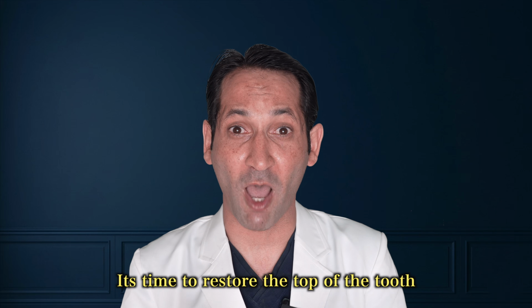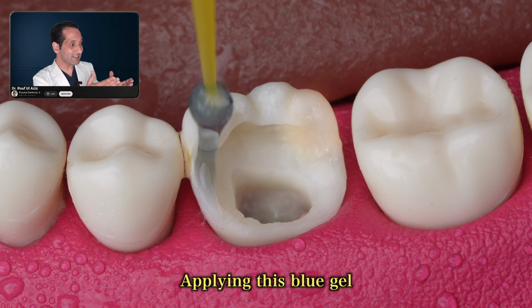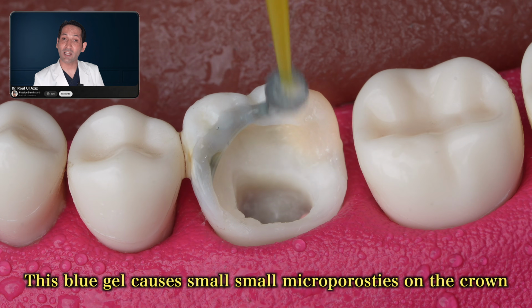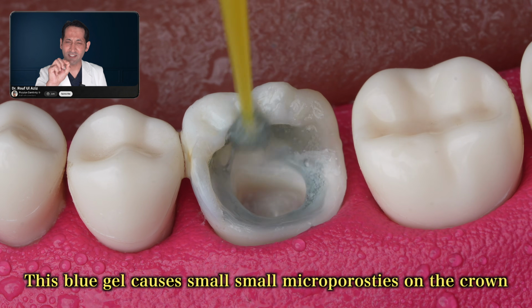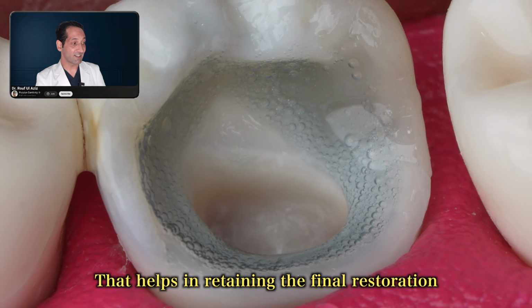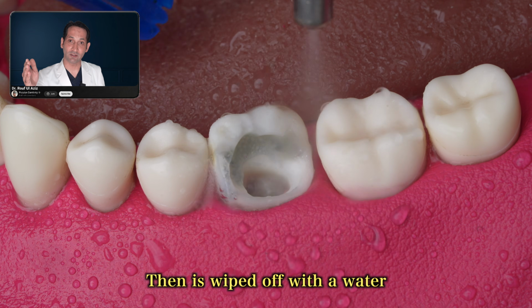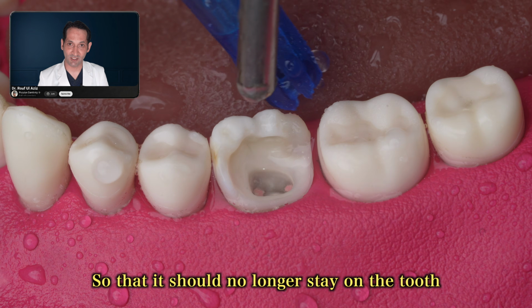It's time to restore the top of the tooth, the crown. And the first step is applying this blue gel. This blue gel causes small microporosities on the crown that help in retaining the final restoration. This blue gel stays there for 15 seconds, then is wiped off with water so that it no longer stays on the tooth.